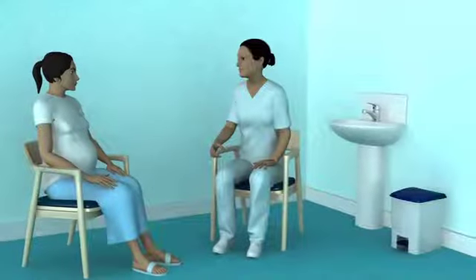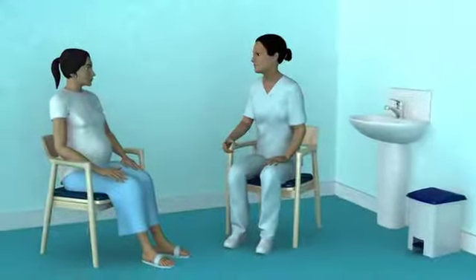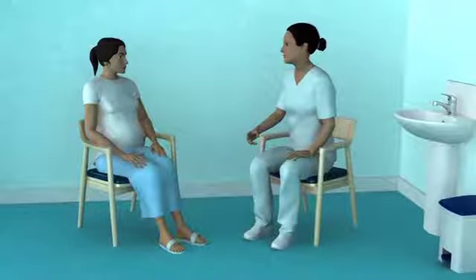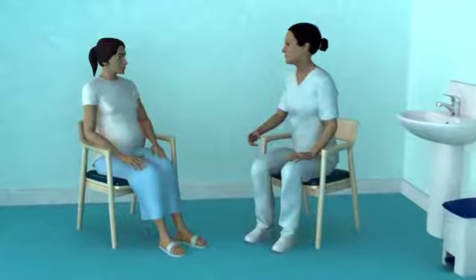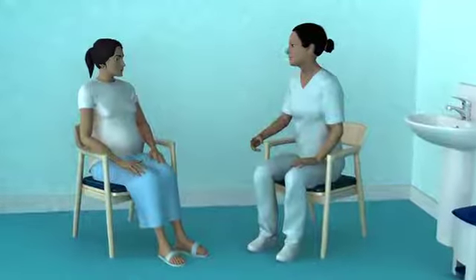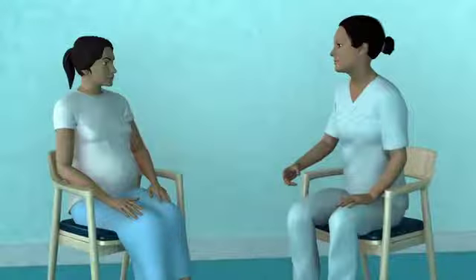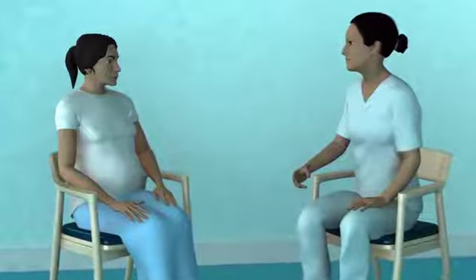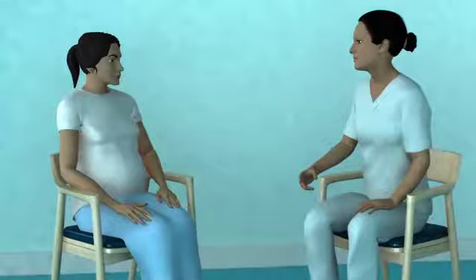Explain the scan results to the woman and give her the opportunity to ask any questions. Provide her with a handwritten or printed report, which she can then pass on to her caregiver. The woman is now free to leave, so you can clear her information from the screen by ending the examination and prepare for the next scan.